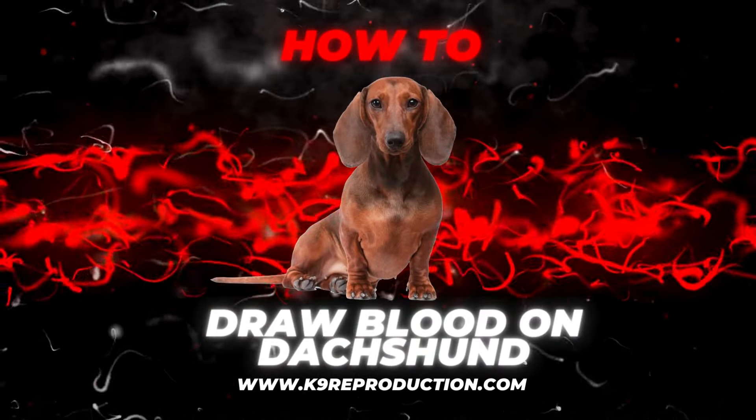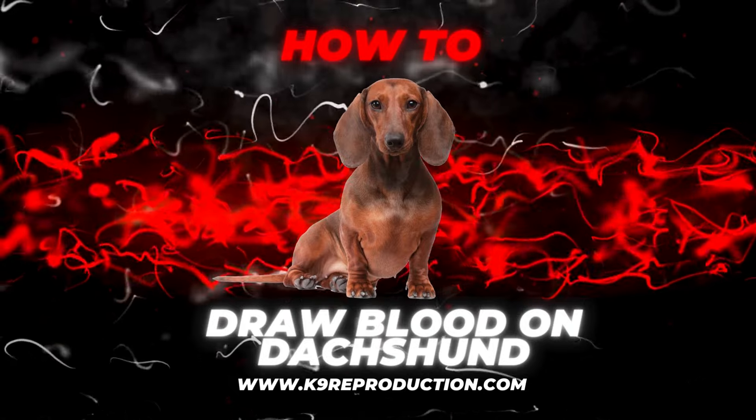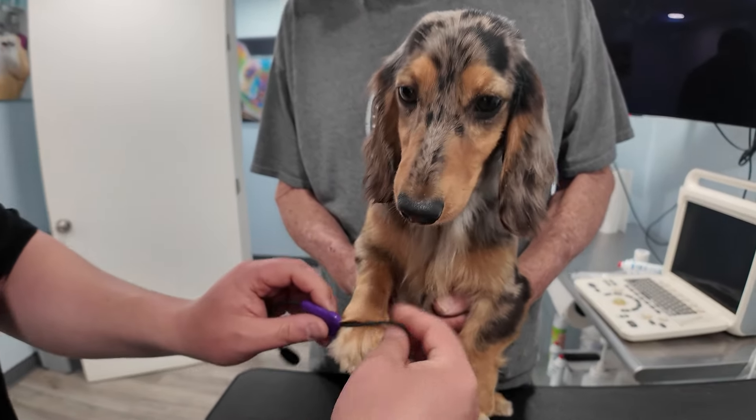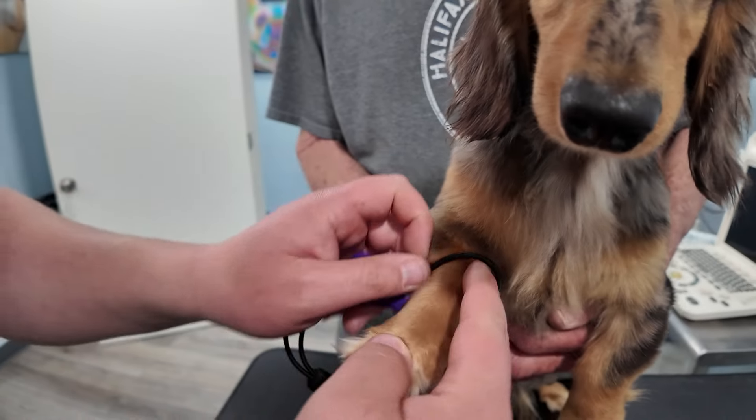Welcome to CanineReproduction.com. This training focuses on blood draws for dachshunds, demonstrating the proper technique for drawing blood from a dachshund.